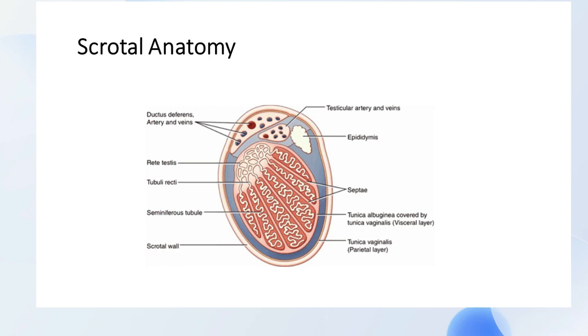So in this image captured here, again, is the basic anatomy. You can see this is our testicle here. In between, there is a space that contains free fluid. We call this the tunica vaginalis cavity or space. And then what we have here, that's our scrotal sac, that's the scrotum there.